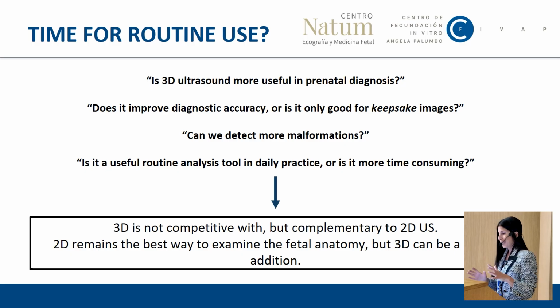So, a very important question here: is it time for a routine use of the 3D ultrasound in obstetrics and fetal medicine? From the 1980s, several attempts were made to develop 3D ultrasound systems. Many highly experienced operators were skeptical about the necessity for this new technology, and typical questions were: is 3D ultrasound more useful in prenatal diagnosis than 2D ultrasound? Does it improve diagnostic accuracy? Can we detect more malformations? Is it a useful routine analysis tool, or is it more time consuming?